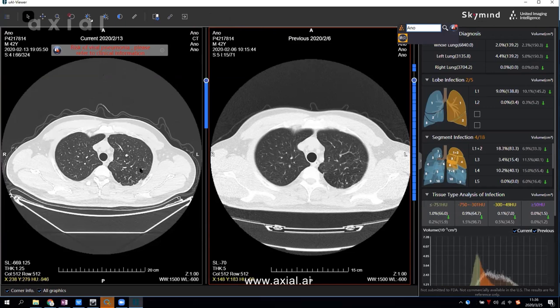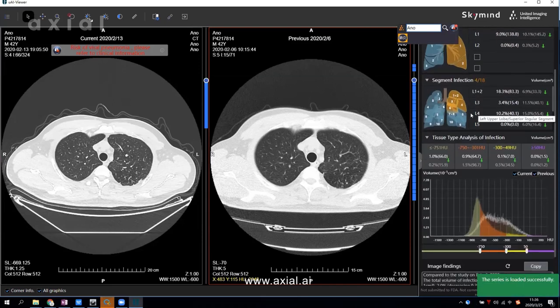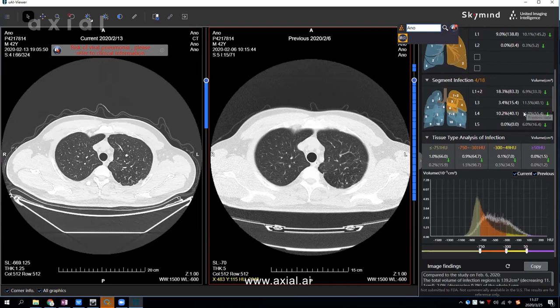This indicates that the patient is getting better. Looking at the quantitative measurement, you can see the green arrow showing the whole lung infected region is reduced. Down to the infected segments, you can see they are all improving as well — it shows the volume shrinkage and how much each segment has shrunk, giving you a clearer idea of which segments the treatment is most effective for.